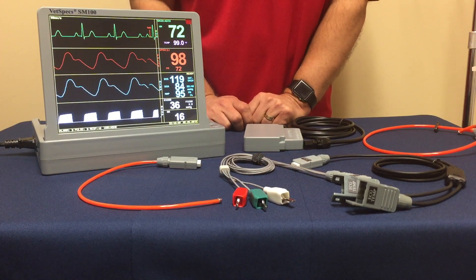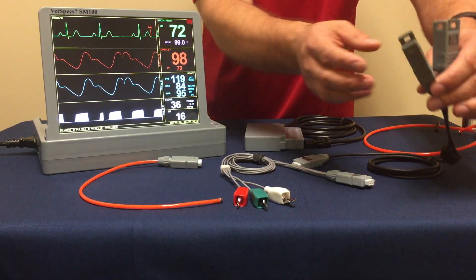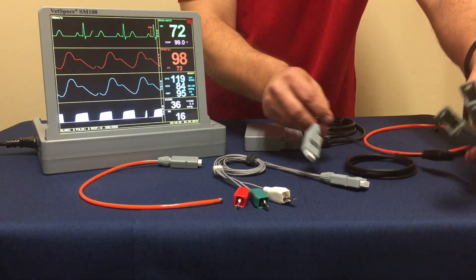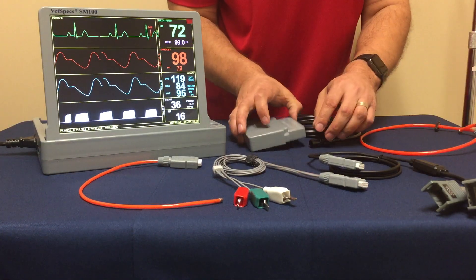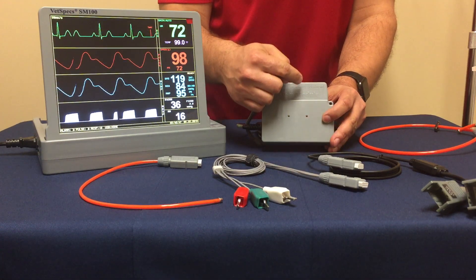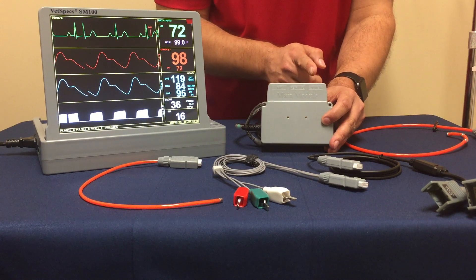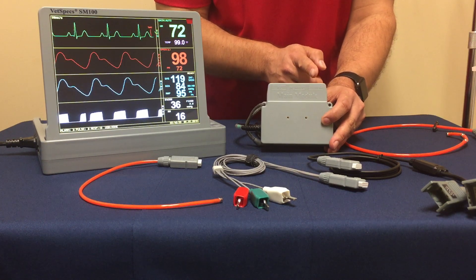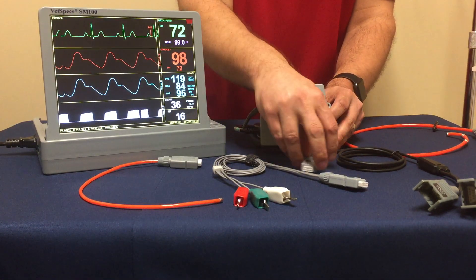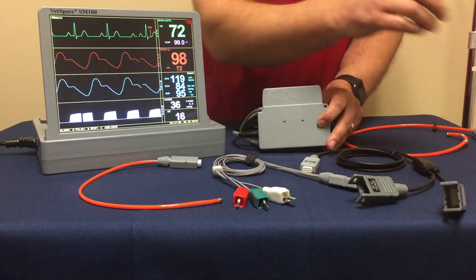As far as obtaining this information, VetSpecs is providing what is referred to as a Y adapter cable. This is necessary because it utilizes the main module by attaching to it. There are three ports: your SpO2, respiration CO2, and ECG temperature. We simply attach this three-foot cable to the ECG temp port, and this cable electronically separates the functions of ECG and temperature.